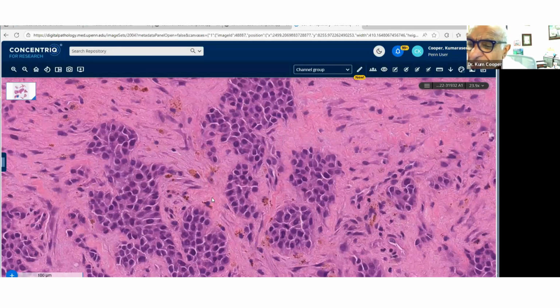I'll get that out of the way. It's not plasma cells. Chordoid meningioma was given, and SSTR was negative. I didn't finish that sentence. There's a chordoma here as well. So, if this is base of skull, sure, you'd be thinking of chordoma, but not the conventional classic one. If anything, you may raise the possibility of poorly differentiated chordoma.